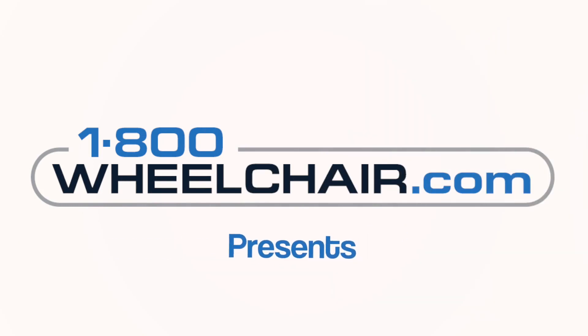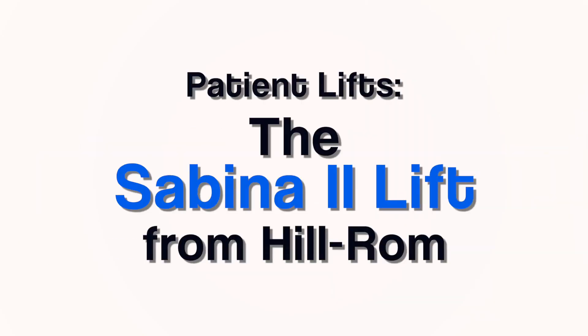Ladies and gentlemen, the moment has arrived. Hi, I'm Joseph from 1-800-Wheelchair.com. Today we're going to talk about the Sabina 2. The Sabina 2 is a badass lift — it's both a sit-to-stand lift and a patient sling lift.